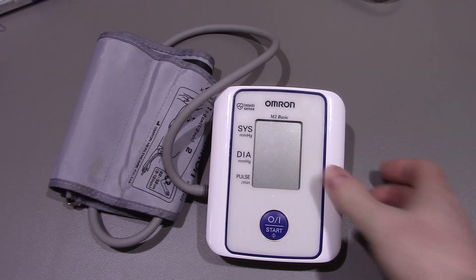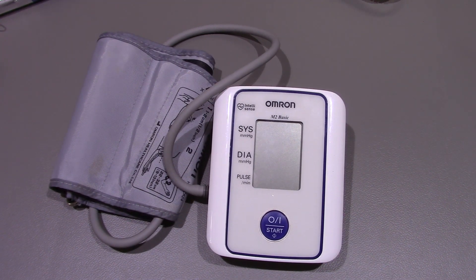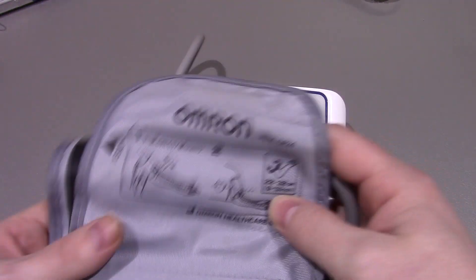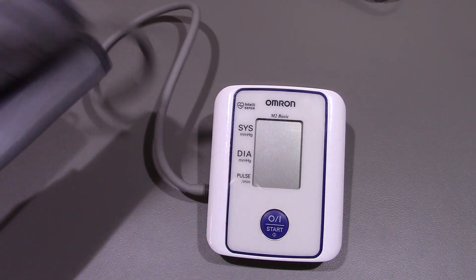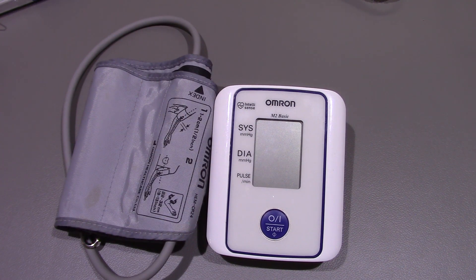Today we're having a look at this Omron M2 Basic - if I'm pronouncing that correctly. It's basically a blood pressure monitor; it does your blood pressure and your heart rate. I've had this one for about two years now. It's pretty much the same as what you actually get in GP surgeries when you see your doctor.